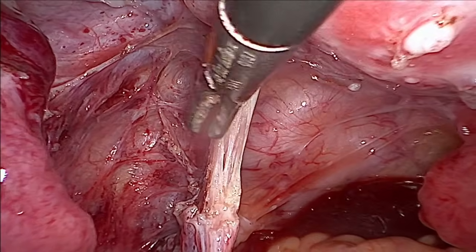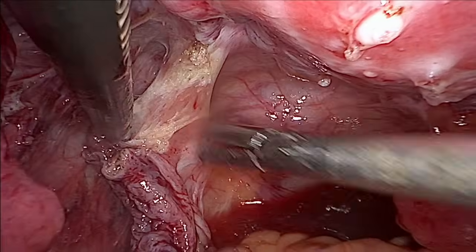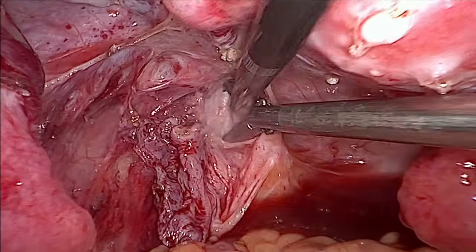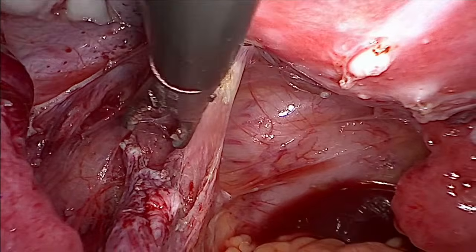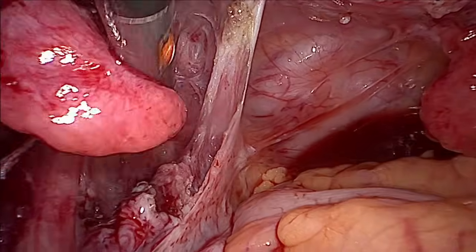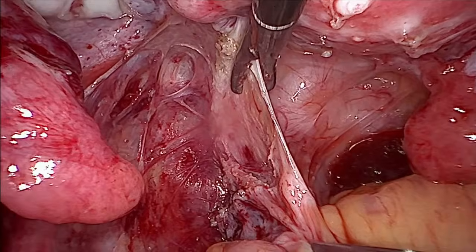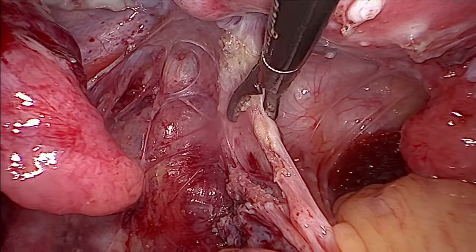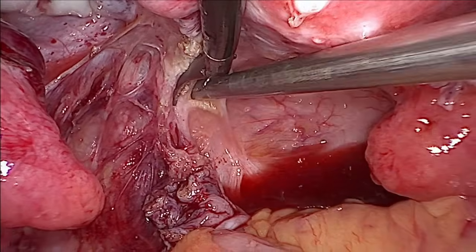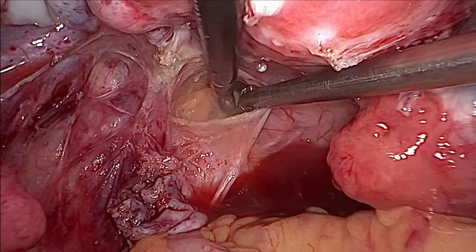You put a nick and gently dissect the spaces. Now I can safely remove this whole peritoneum. Now I am in the pararectal space here.